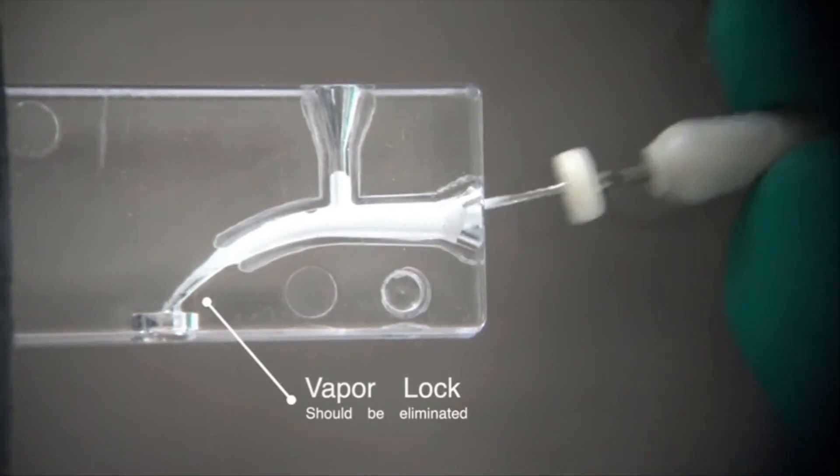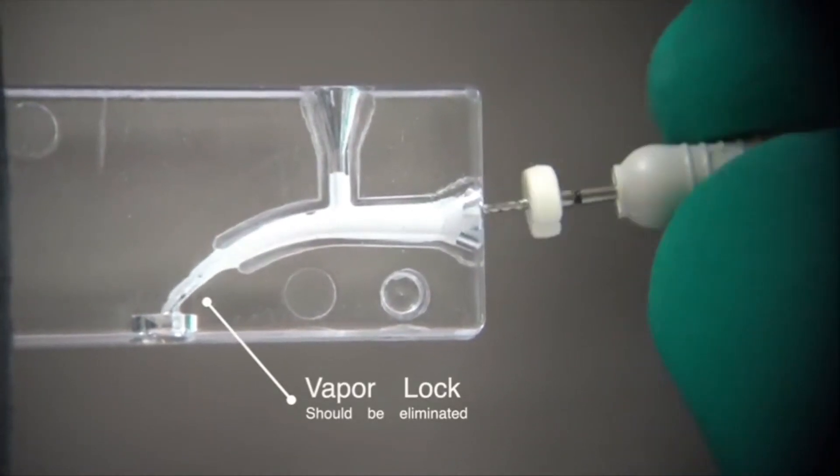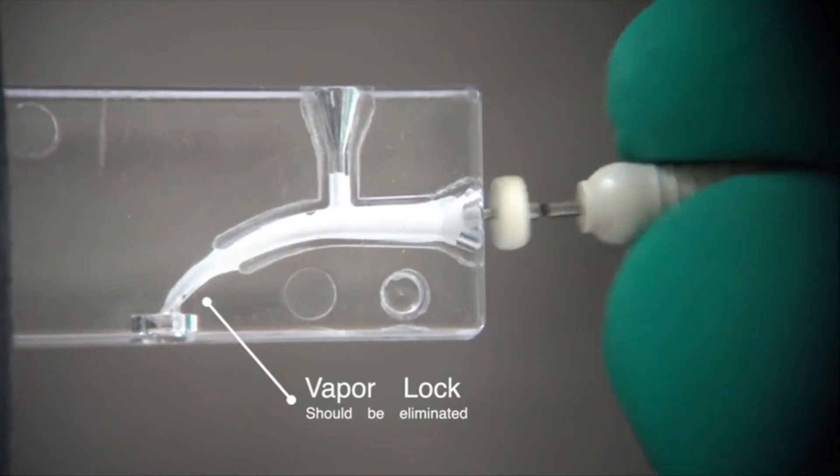It's done in order to puncture the vapor lock that is present at the apical part of the canal. You need to puncture it using a file; whichever file size you use is fine.